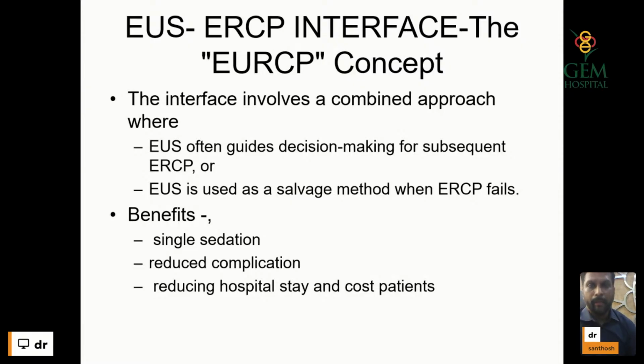This combined approach is used when one modality fails. EUS often guides decision making for subsequent ERCPs, or EUS can be used as a salvage method when ERCP fails.